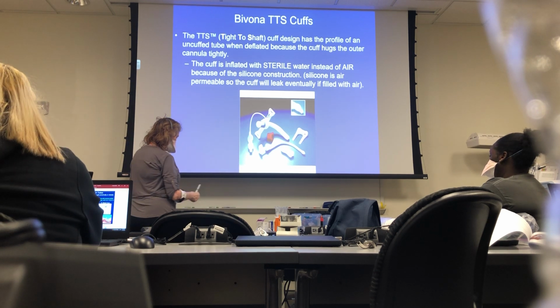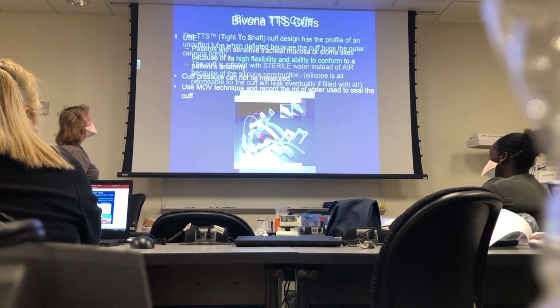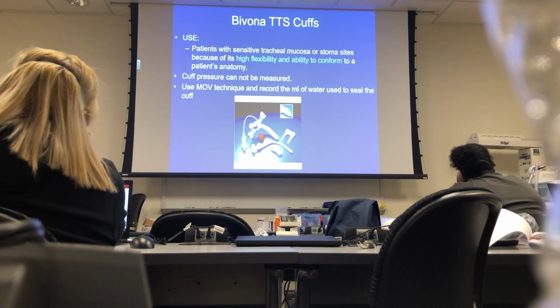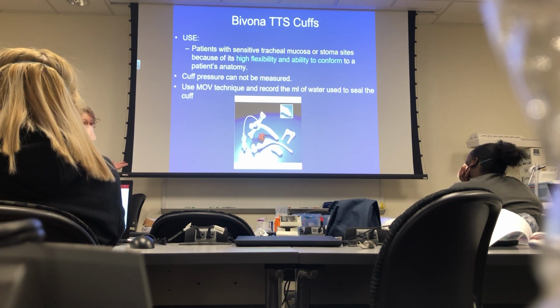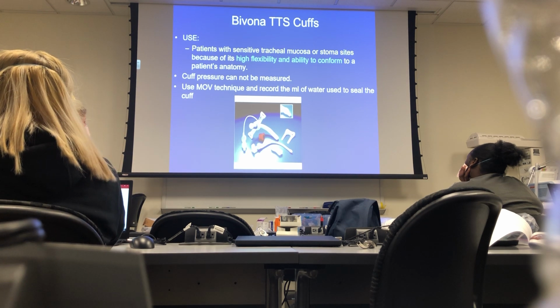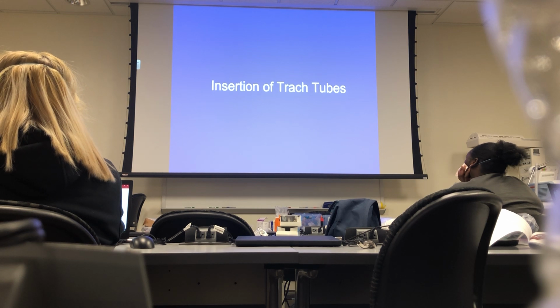So those you'll see at University of Maryland. I've never seen them at hospital center. They have high flexibility. I don't even have one of those to show you. Cuff pressure can't be measured because the pilot's filled with sterile water. And why do we fill with sterile water? Huh?